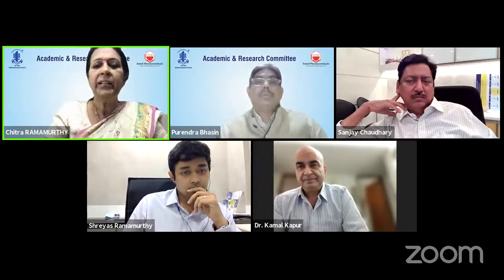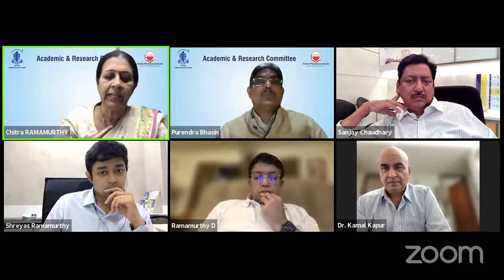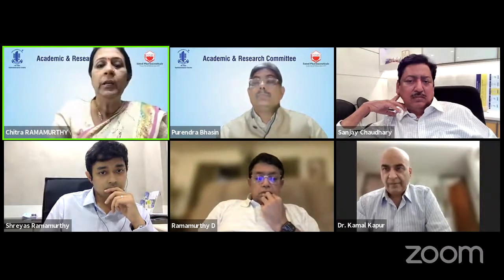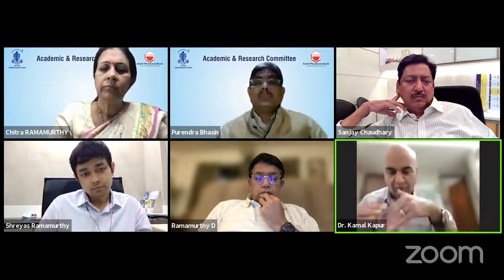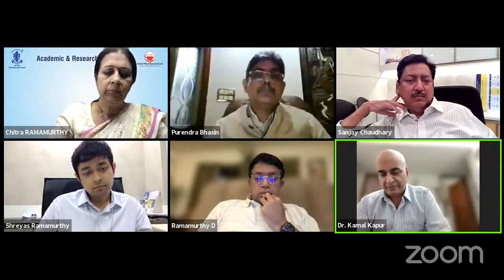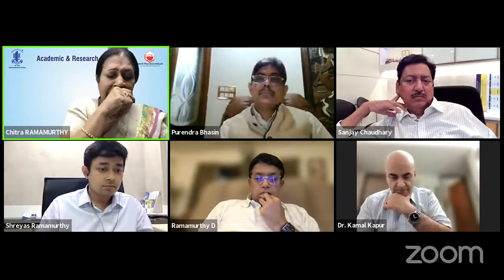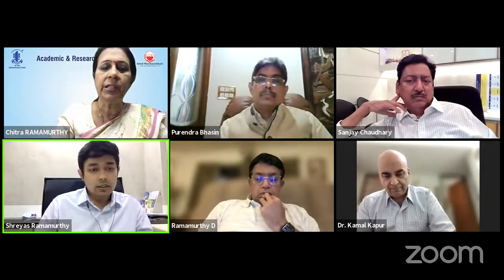So is it important for all of us to think that we should also measure the lens rise, and that it has an impact on the sizing of the phakic IOL? Shreyash, would you want to add? I feel especially when you have a lower vault, that's when the lens rise really comes in. That's very important. Yes, Shreyash, because some of these were on sizing of IOL. Do you have anything to add? Because there have been wonderful discussions now.